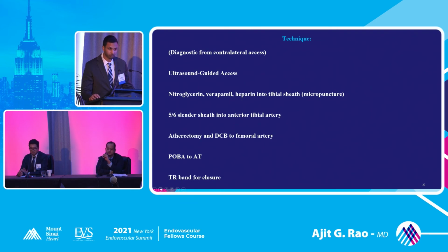Just from an interventional perspective, when we're doing this, what I want to know is which part of the artery we should access so that in case we fail, we at least leave a zone open for you guys to bypass. Yeah, I think that's a great point. So when considering pedal artery access, I try to go in a healthy segment. Number one, you don't want to stick the artery where it's calcified or diseased because you're going to have a higher likelihood of failure.